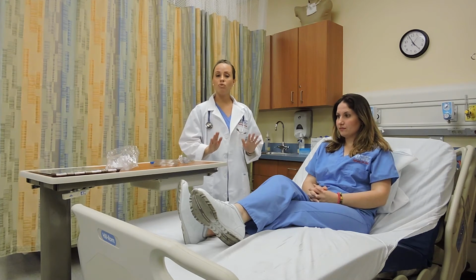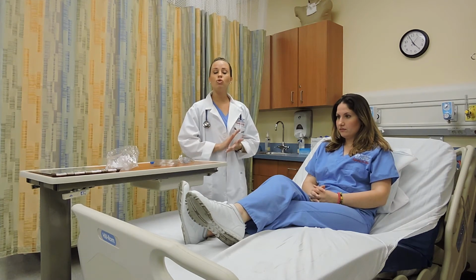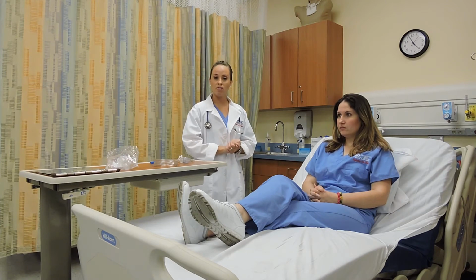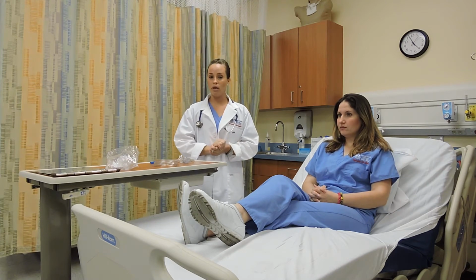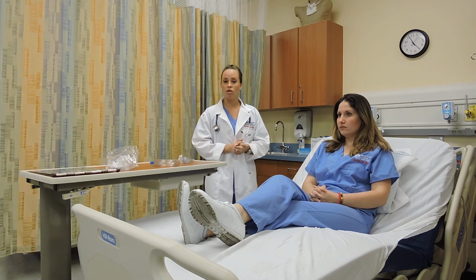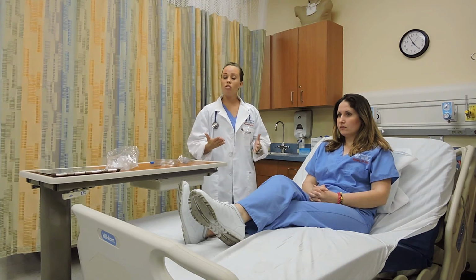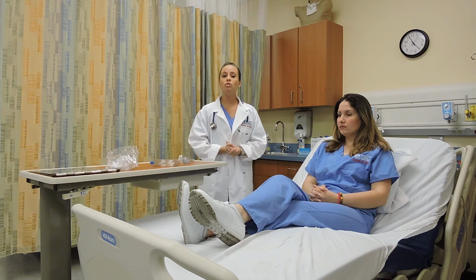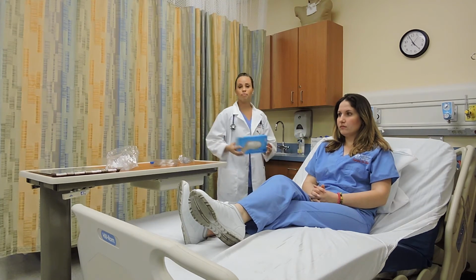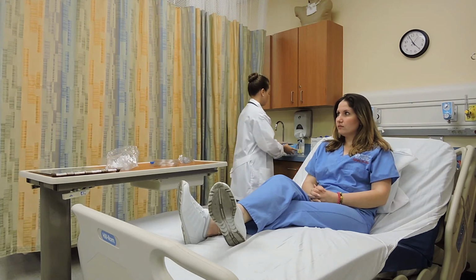Before you attempt to do any patient assessment, make sure to perform hand hygiene by washing your hands no less than 15 seconds or utilizing the alcohol-based hand rub, which for these video purposes, I'm only gonna verbalize. Once you're done with hand hygiene, proceed to don the appropriate PPE, and in this specific procedure, we're only gonna use gloves.